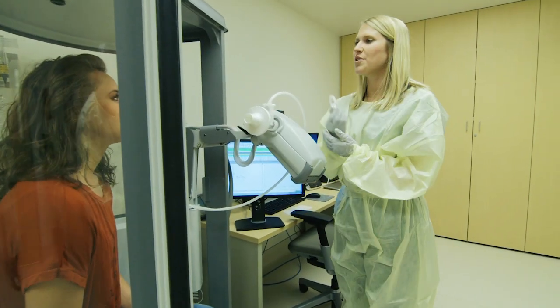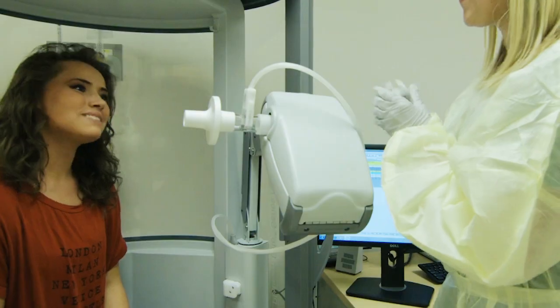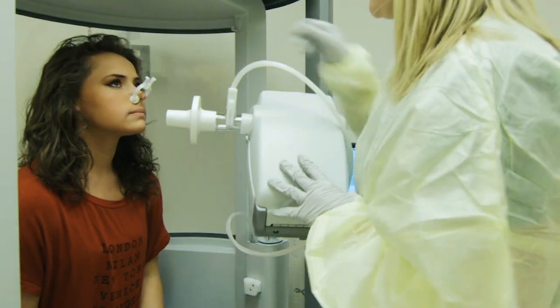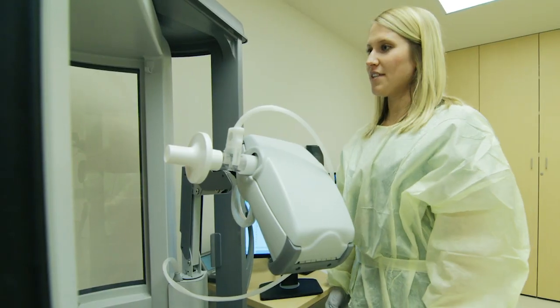To do this test you will use a filter and a nose clip. The nose clip helps to make sure that all of the air is going in and out of your lungs through your mouth. To start you will need to sit up nice and straight.